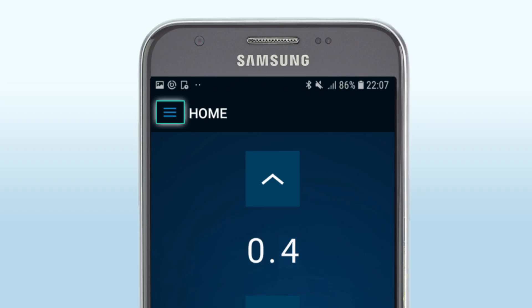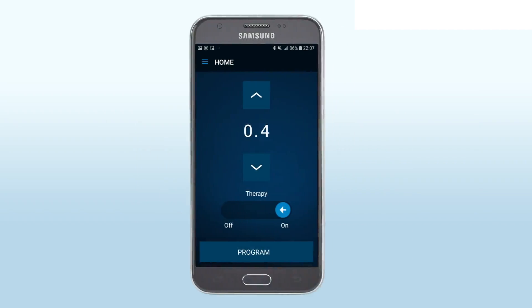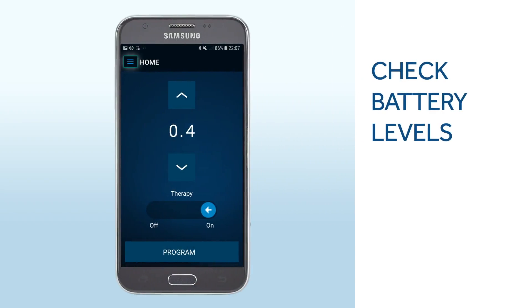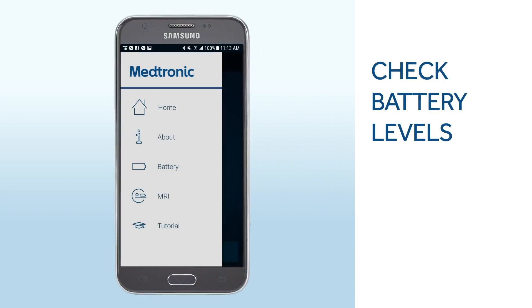You can also activate and deactivate MRI mode. To check battery life, tap the Menu button, then tap Battery to display the information.